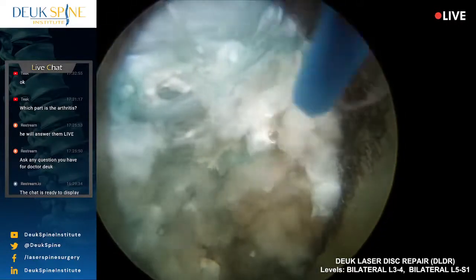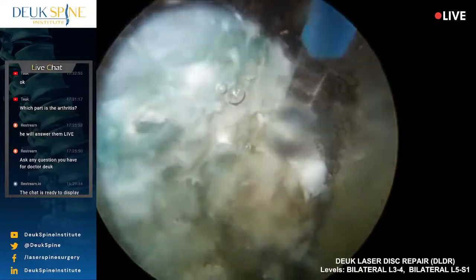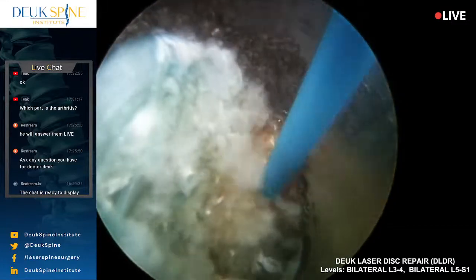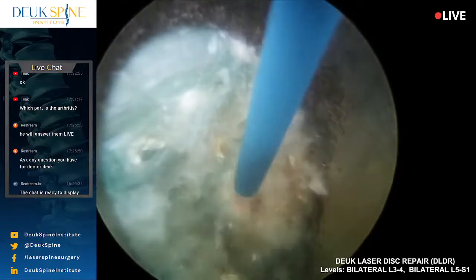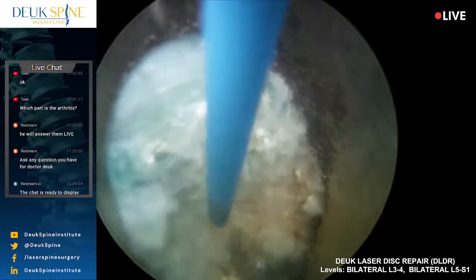Sounds good. Look at all that scar tissue. All right, we're just about done with this disc. And this is clearly different than the last one. The last one was a lot softer, like a soft cheese. This is harder, more like a mimolette. Maybe that's what I thought about mimolette, because I feel like this disc is like a mimolette.